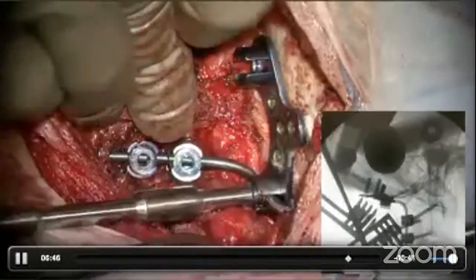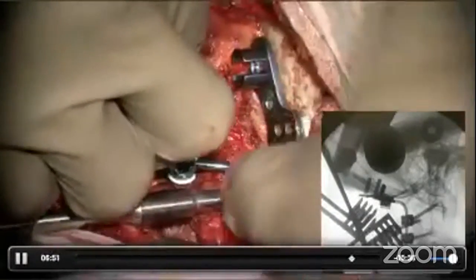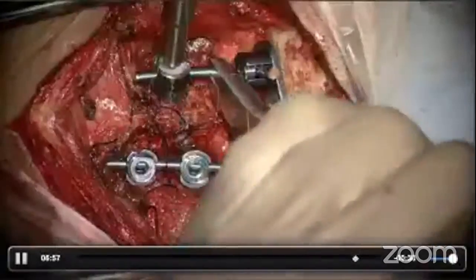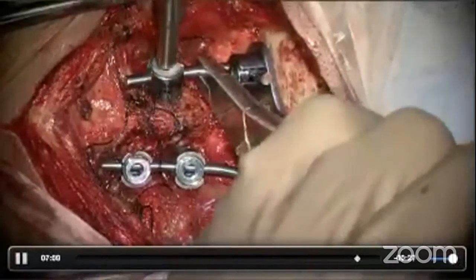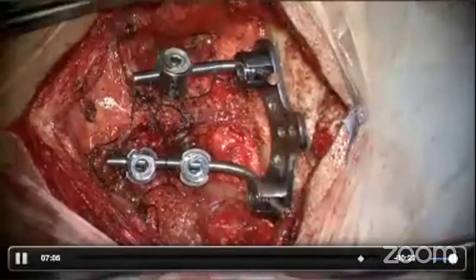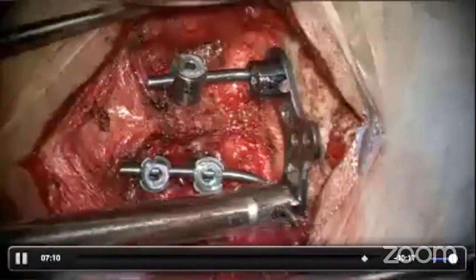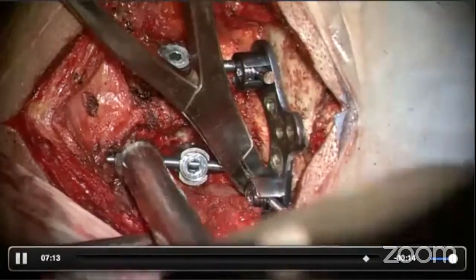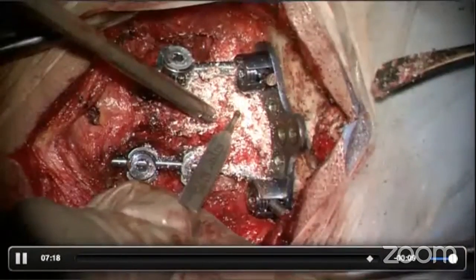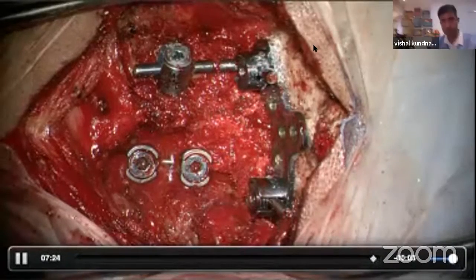If the rods are under-contoured, then by cantilevering the rod to the occiput, one can push the odontoid forward. In addition, the alignment can be changed by compression and distraction over the rods. While tightening the rods, either use a rod holder to provide counter torque or an anti-torque device. This prevents stressing of the screws. The final step is the decortication of the posterior bone surface and placing onlay bone graft over it. Thank you very much for watching.